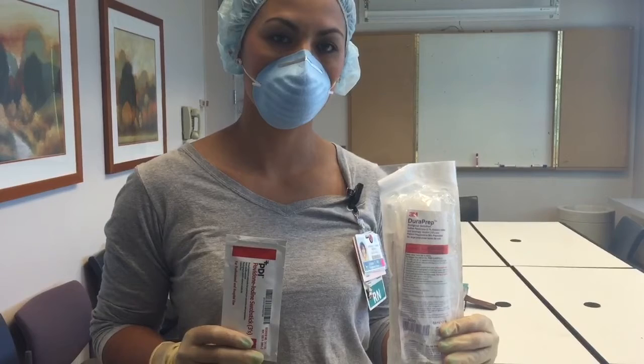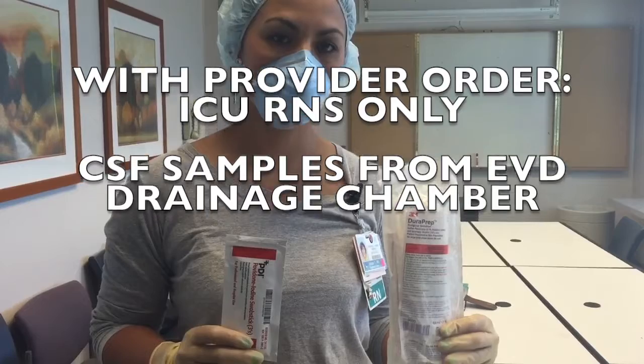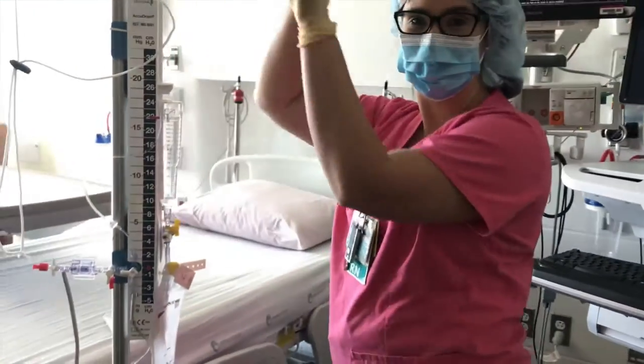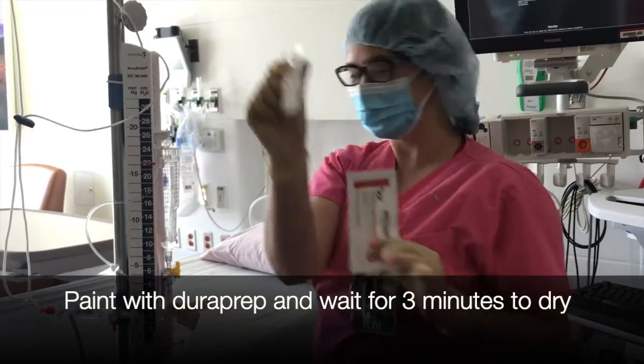ICU nurses may obtain CSF sampling only from the EVD drainage chamber of the device. When accessing the EVD drainage chamber, hand hygiene, mask, sterile field, and sterile gloves will be used.